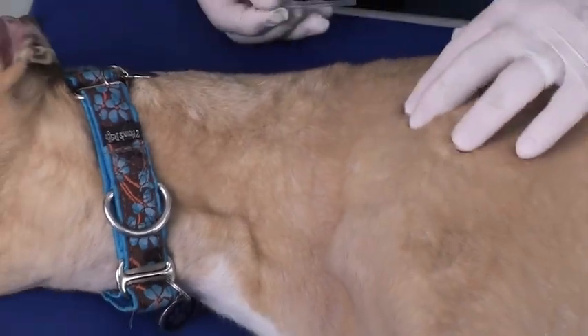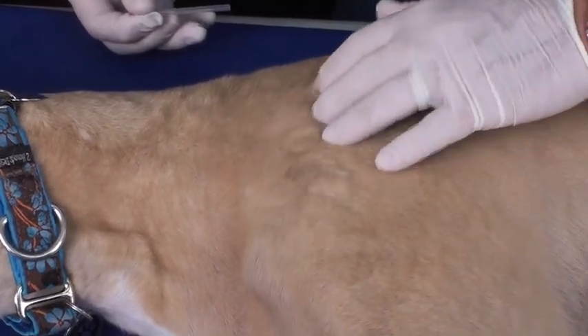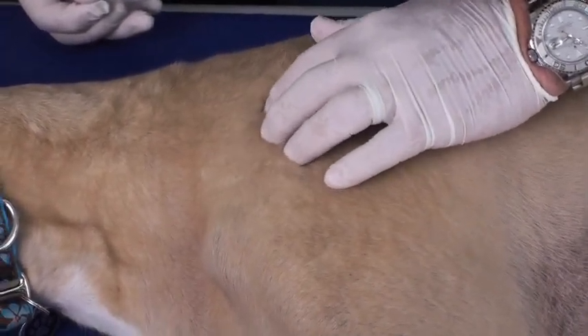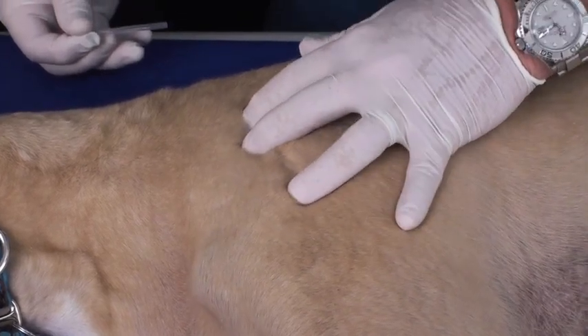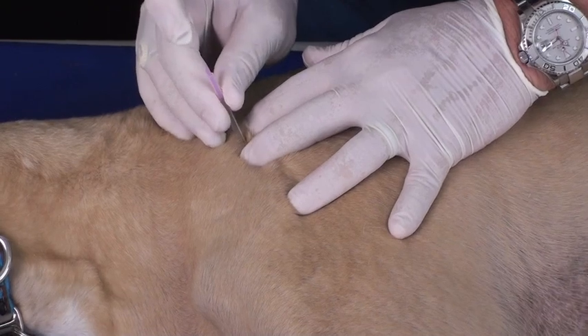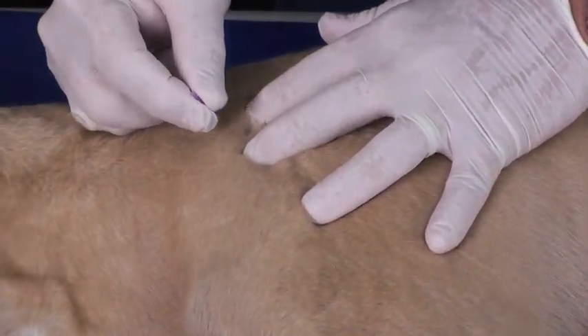We want to identify the muscle that we treat — in this case we are going to be doing the supraspinatus. We are going to palpate for taut bands, isolate that taut band, put the needle over that, rapidly put it in, and now we are going to slowly direct it into that band.